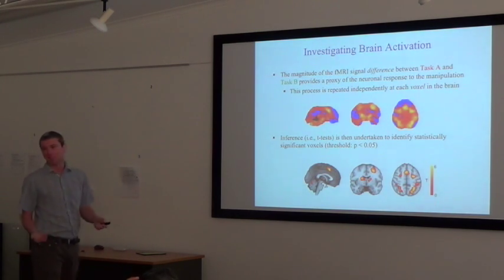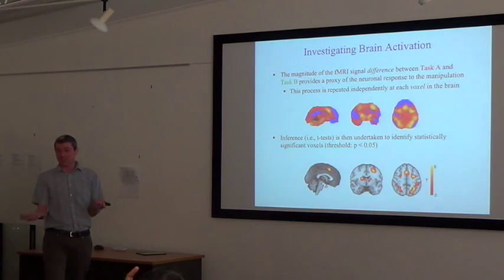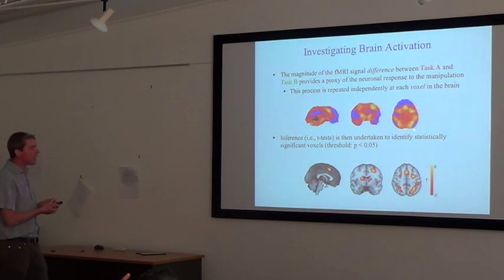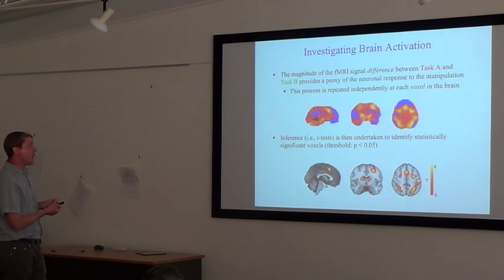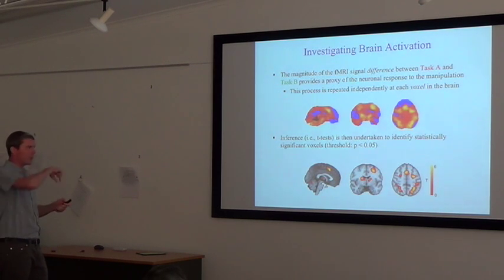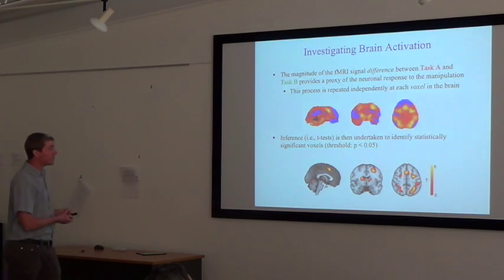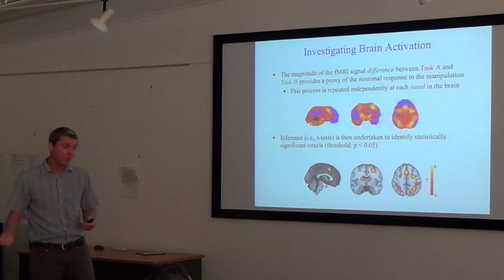It gives us high impact publications. But it's also very useful because otherwise each of these colors just represents a number. In this case, it's an effect size. Blue is actually negative, so it's the flip, where B is greater than A, whereas all the red and the orange is A greater than B. And we just use these colors as a nice representation of a statistical map.